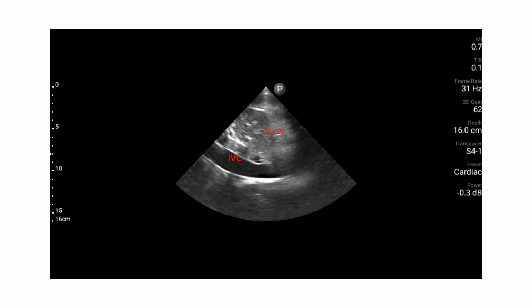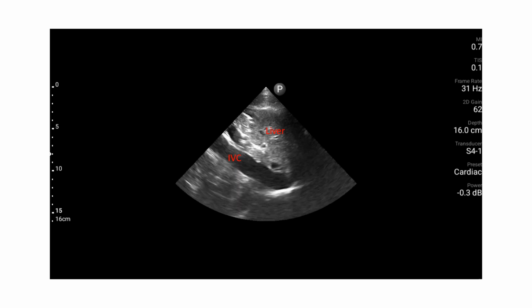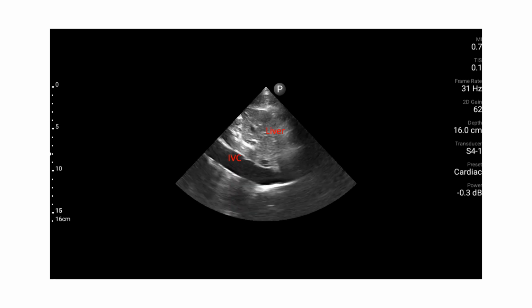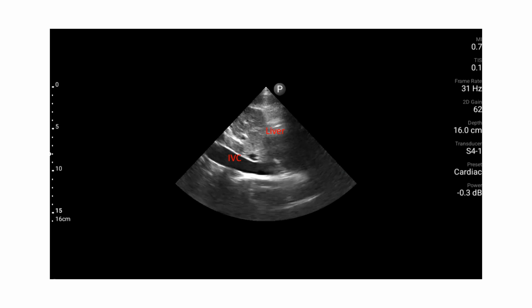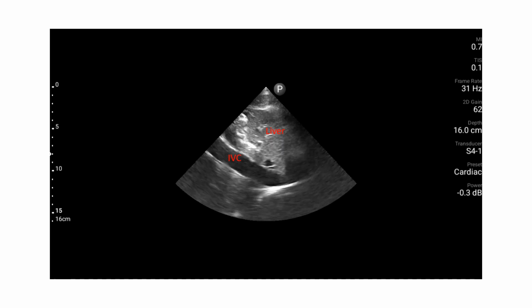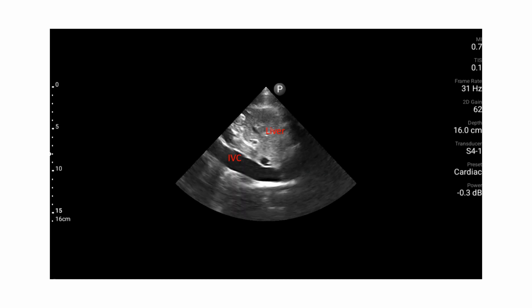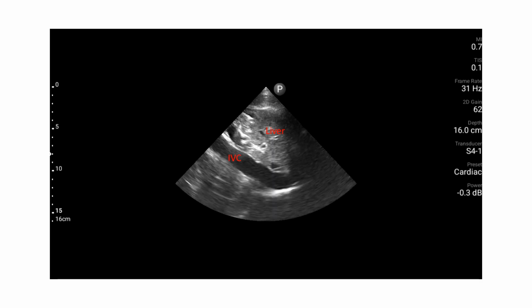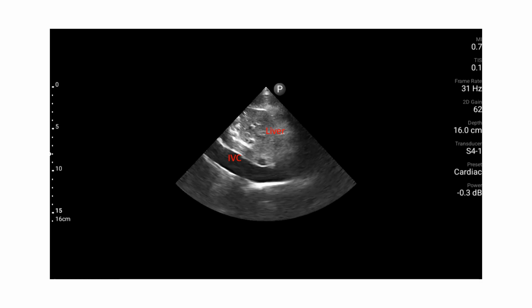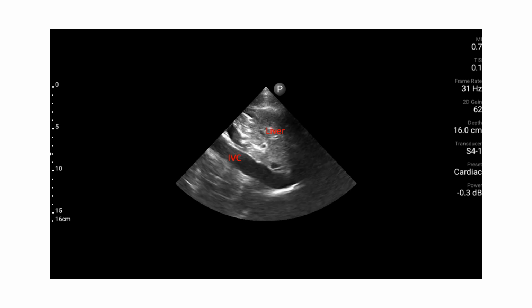And even in the absence of its predictability of the cause of the shock, it fairly accurately can at least tell you that the patient could tolerate a fluid bolus and that it is safe and reasonable to trial that. So rather than getting in the weeds about using it as a diagnostic tool to determine the actual disease process, that's not really what we care about in the sick crashing patient. What I care about is I want to stabilize this patient. What information do I have and what can I use it for?